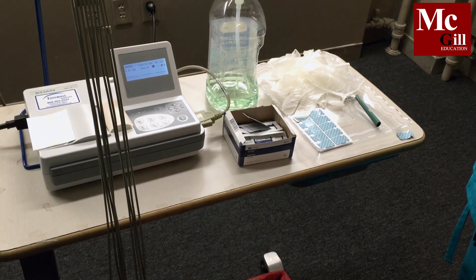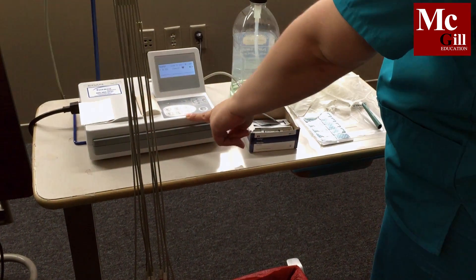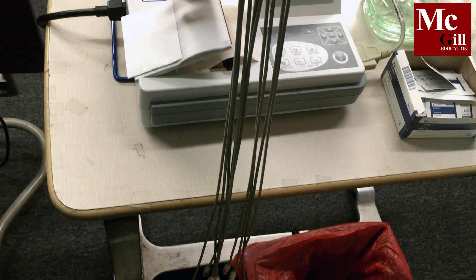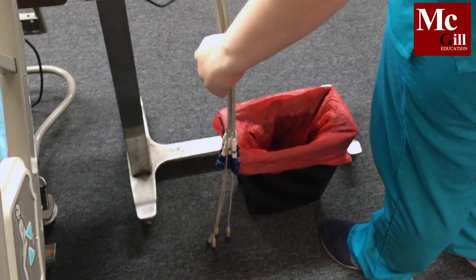First, assemble and prepare equipment and supplies. Your equipment will be your EKG machine. Ensure that there is paper loaded into your EKG machine. Your EKG machine is composed of a cable that splits into 10 additional cables.